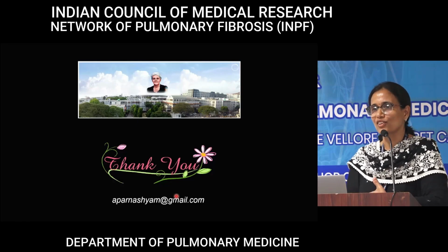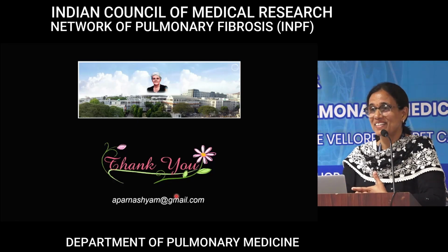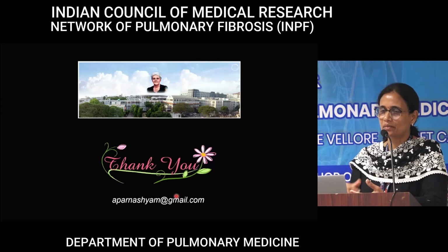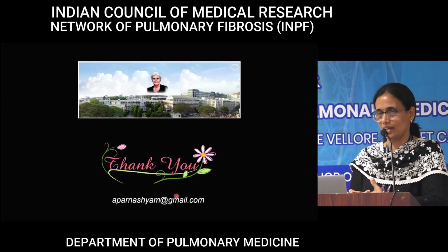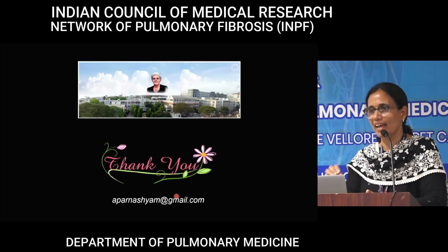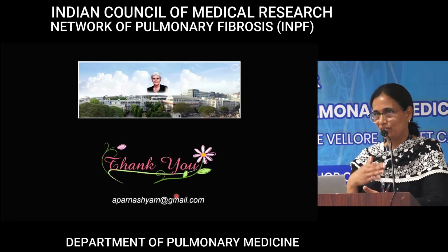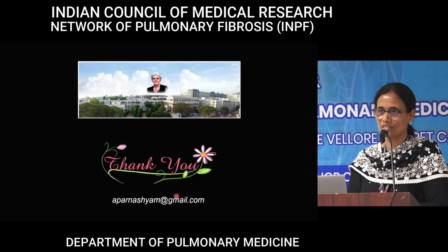What was the third question? Sorry. Lobular air trapping, yeah. So again, basically these are diffuse diseases, right? So it is usually diffusely seen. We're not going to make a diagnosis based on one focus of air trapping or anything. We are just going to look for a diffuse disease, right?